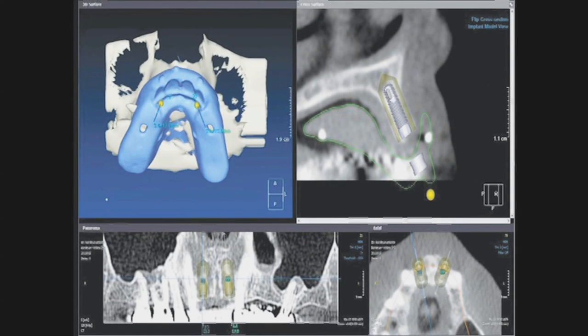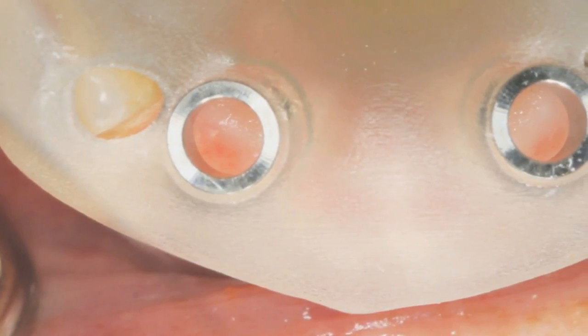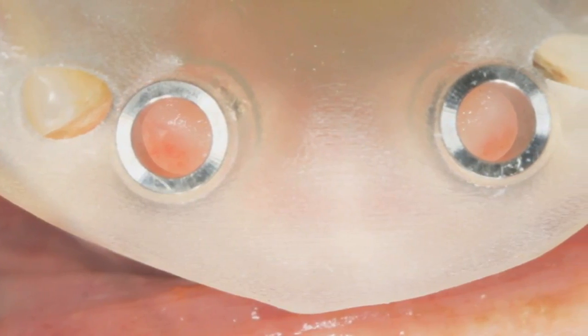In the cases described here today, the CT scan is done with the patient's teeth open at least 5 millimeters. A cotton roll or stack of tongue depressors can be used. You don't want the patient to be scanned in a fully occluded state or clenched, as this could create overlap and inaccuracies of the temporary prosthesis.